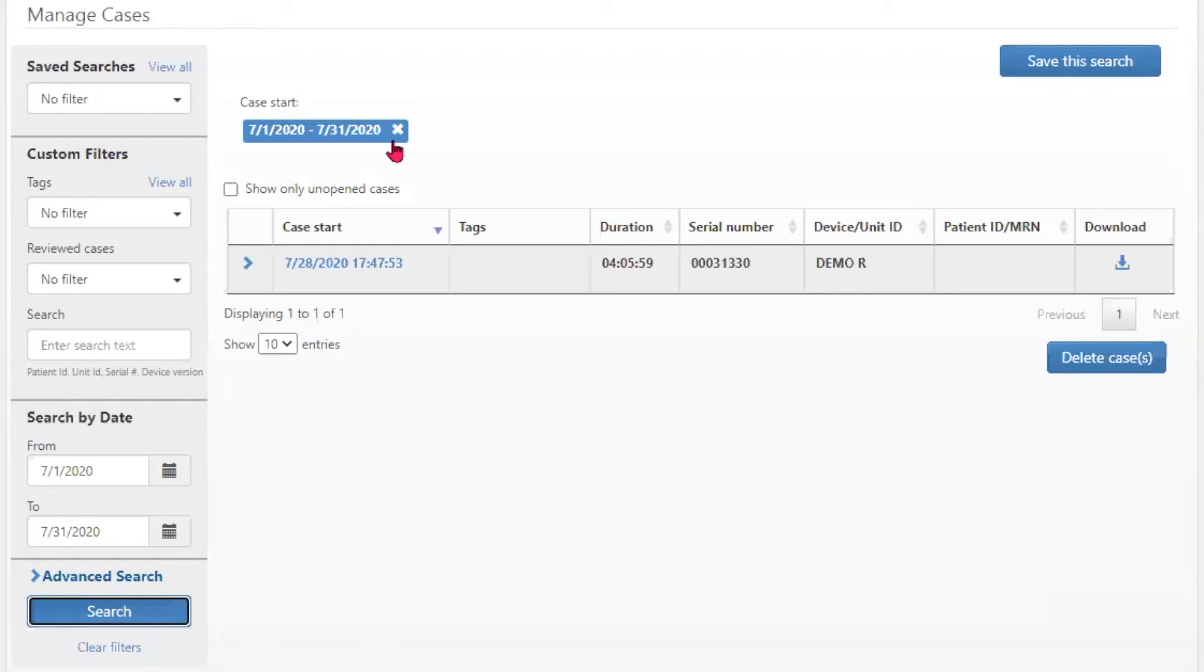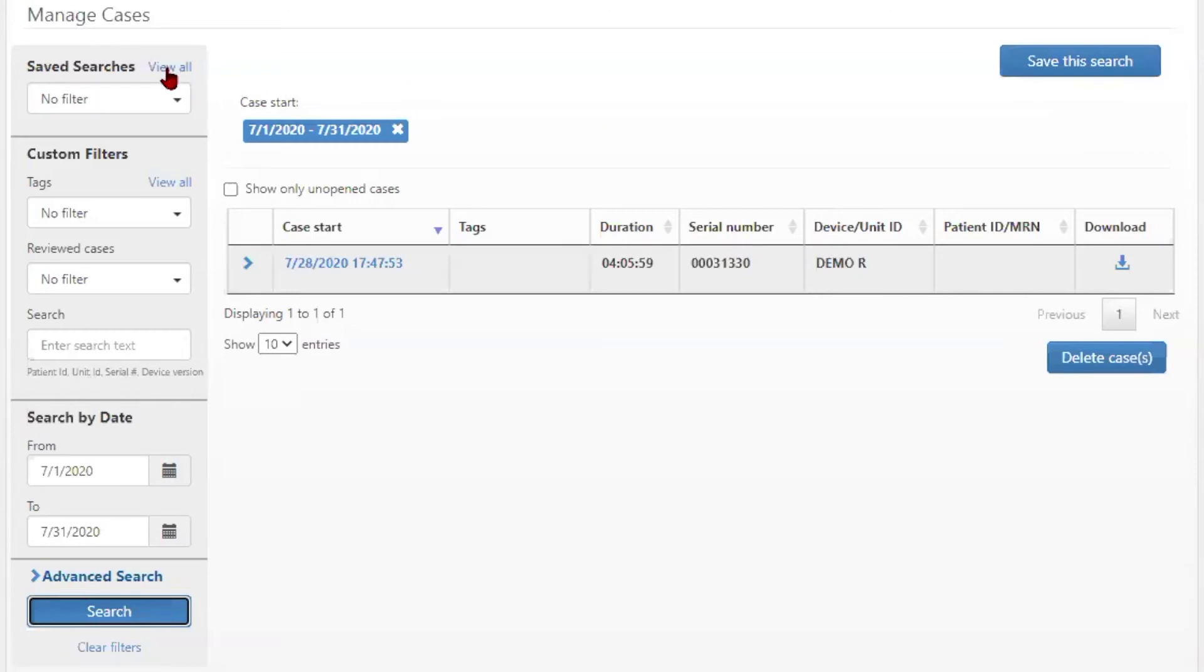Search criteria is displayed at the top of the page, and all searches can be saved by selecting the save search blue button. All saved searches are then available in the view all section of saved searches.